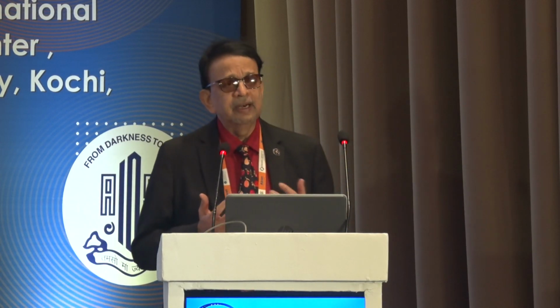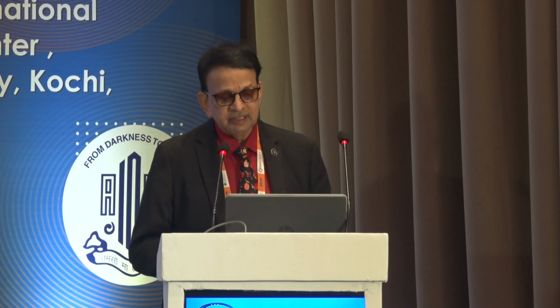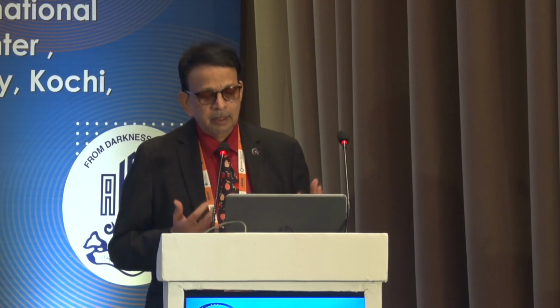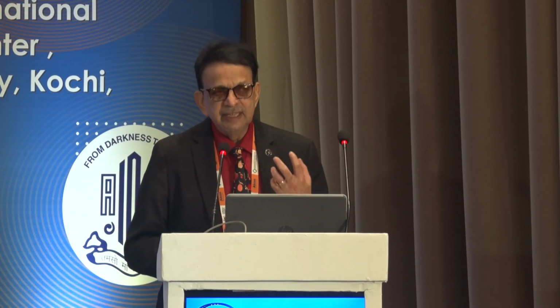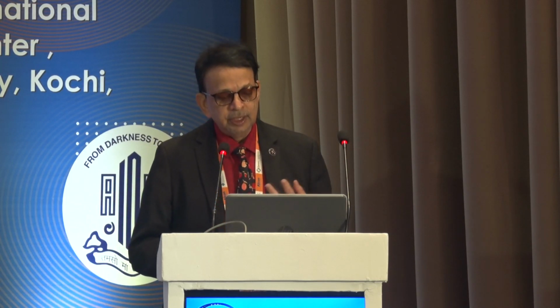So the corneal edema may clear up in about a month. Sometimes it may clear up in about 6 to 8 weeks time with the use of hypersol. But many of the times, the corneal edema can be associated with cystoid macular edema because a lot of inflammatory cytokines and prostaglandins are released into the eye when there's a corneal edema, or you can even have something like a TASS or a fibrin reaction on the lens. When you have a femtophaco, you can consistently deliver clear corneas and pristine wounds as well. You can see the clear corneas day one, and that is the advantage.